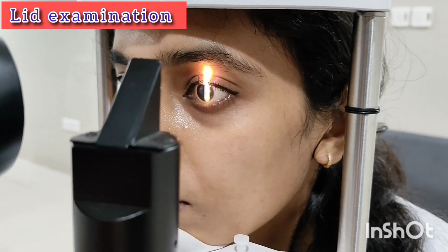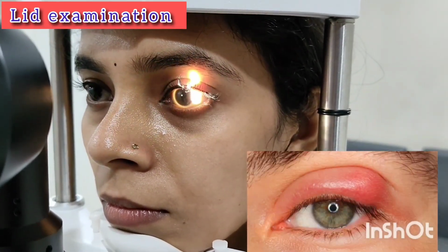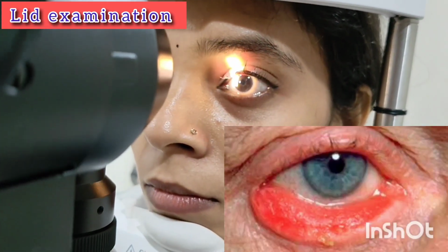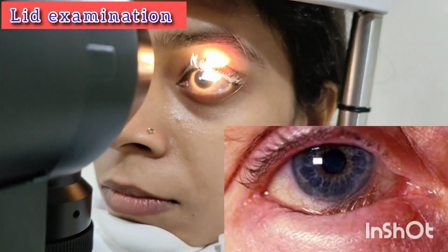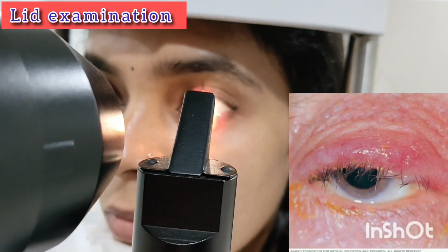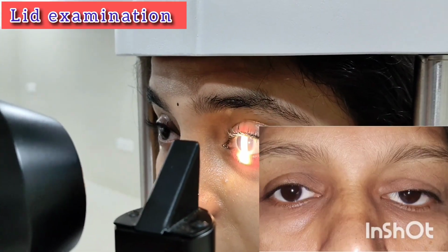Slit lamp examination should start with upper lid and then lower lid. In the lid, mainly we look for swelling, hordeolum, edema, entropion or ectropion, trichiasis, blepharitis, ptosis.